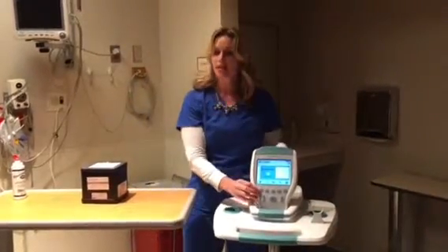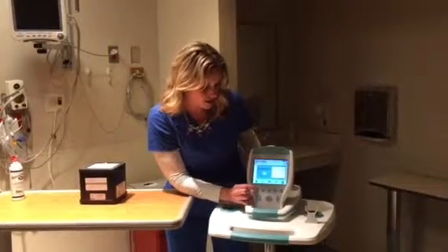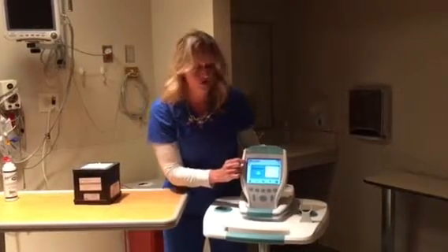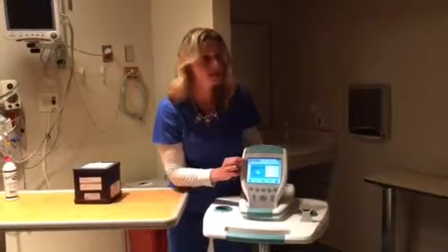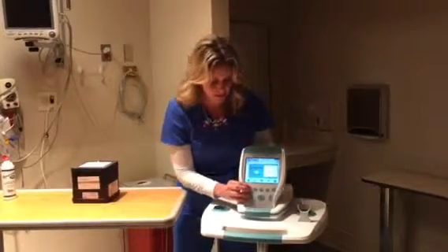First thing you're going to do is tell the scanner if your patient has a uterus or does not have a uterus. And how you do that is by clicking this first button, and you're going to toggle between uterus is present, and that's the female wearing the dress, or uterus is not present, and that's male or your female that has undergone a hysterectomy.